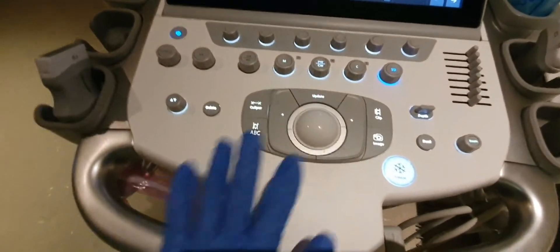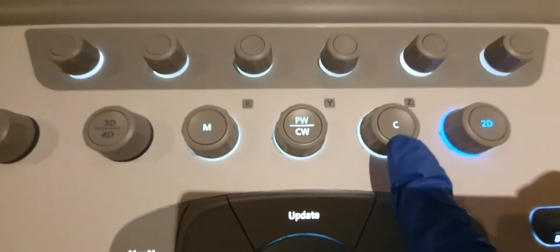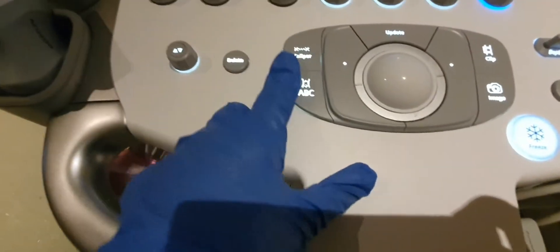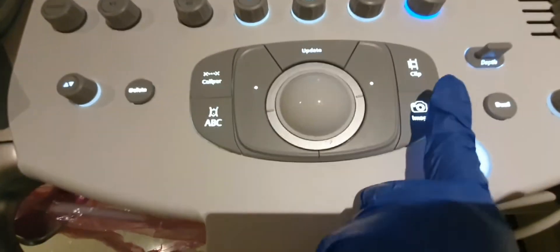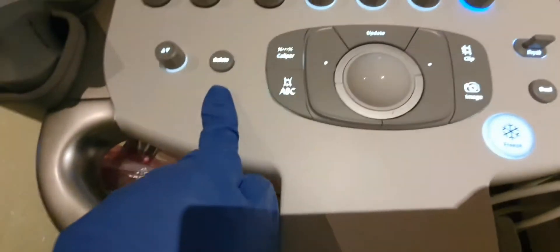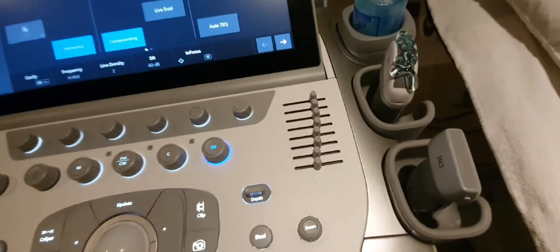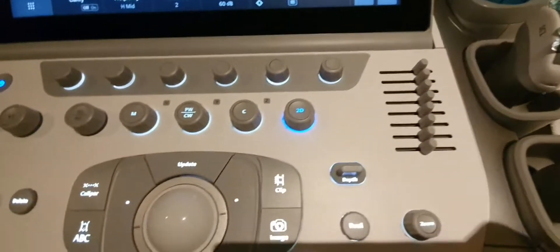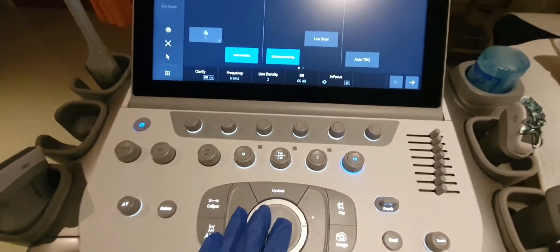I usually use the color button, the 2D button, the pulse wave, the caliper, the annotation, the image save, the video/clip button, depth, dual, zoom, freeze, delete, and the time gain compensation (TGC). First we need to scan the patient.